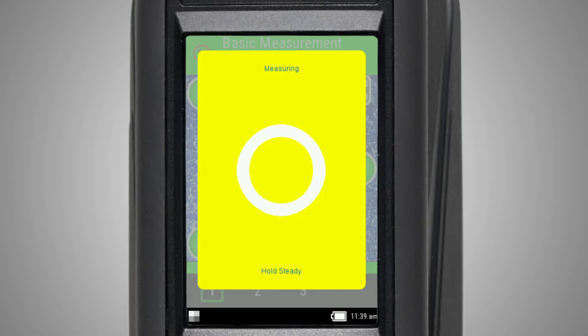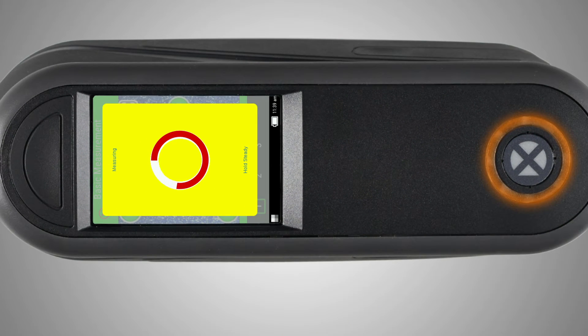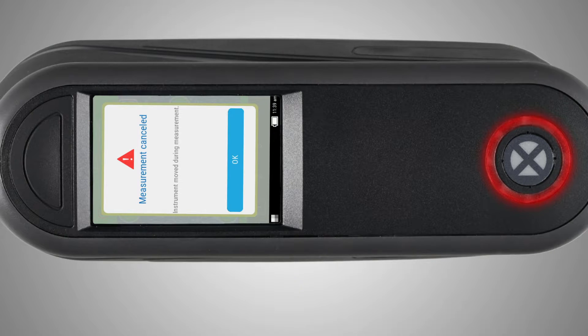The measurement progress will be shown in a yellow box. The color LED will also appear orange. If the correct pressure is not maintained for the duration of your measurement, an error message will be displayed and the LED circle will turn red.